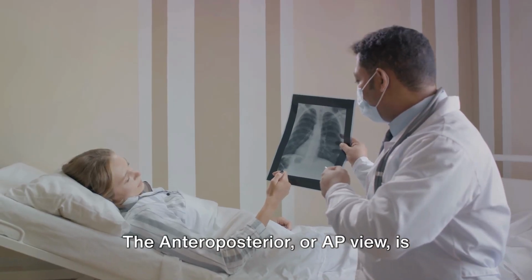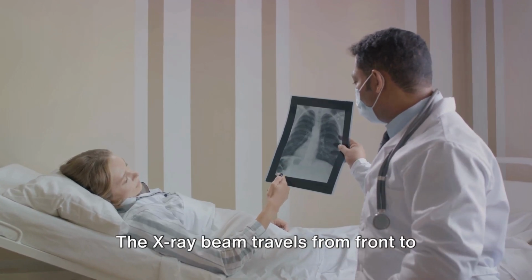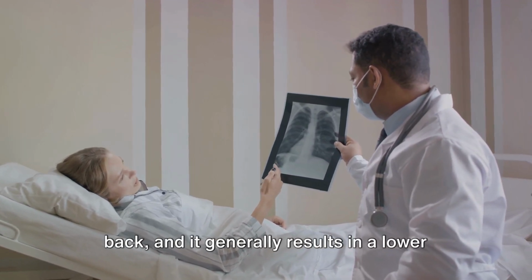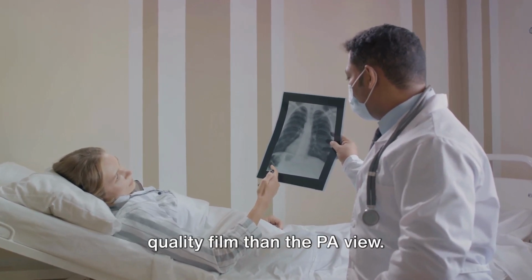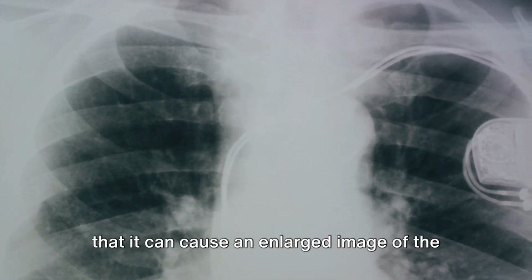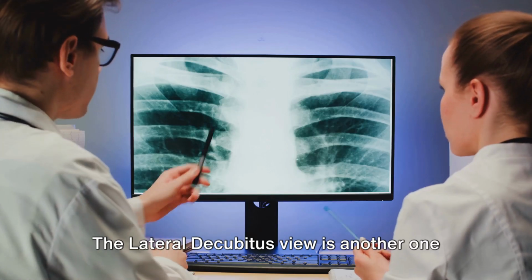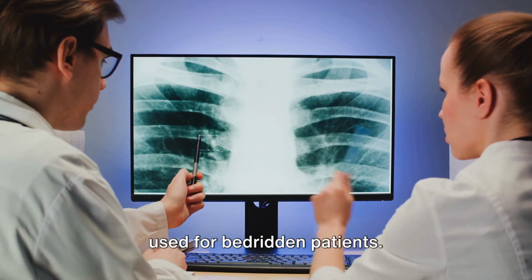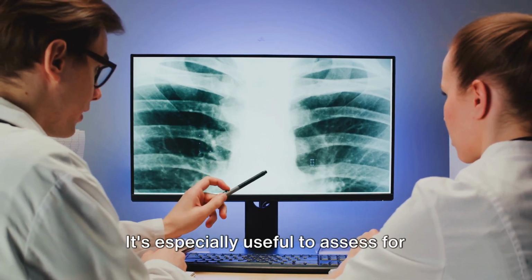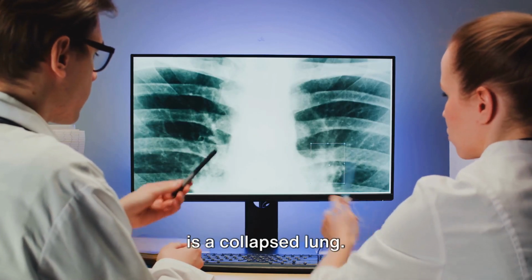The anteroposterior, or AP view, is typically used for bedridden patients. The X-ray beam travels from front to back, and it generally results in a lower quality film than the PA view. One of the key features of this view is that it can cause an enlarged image of the cardiac silhouette. The Lateral Decubitus view is another one used for bedridden patients. It's especially useful to assess for pleural effusion and pneumothorax, which is a collapsed lung.